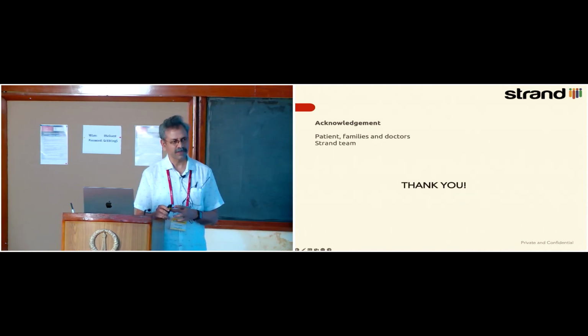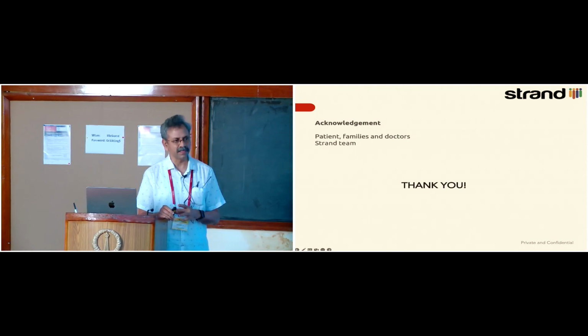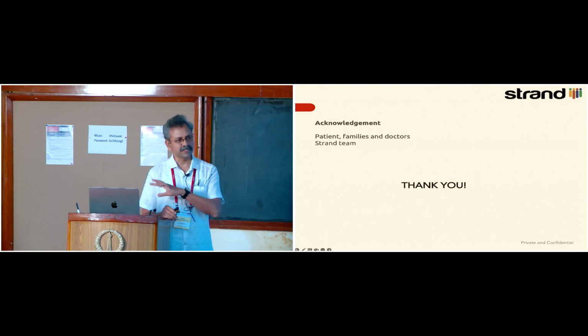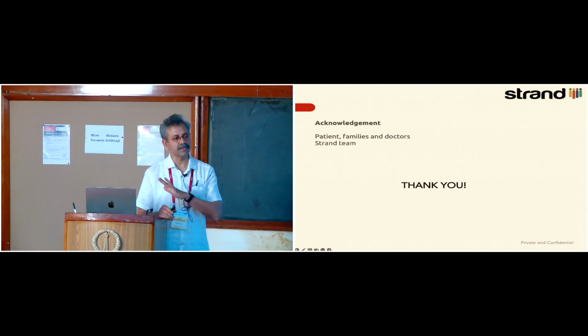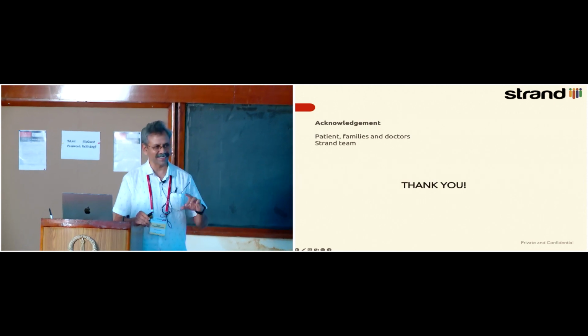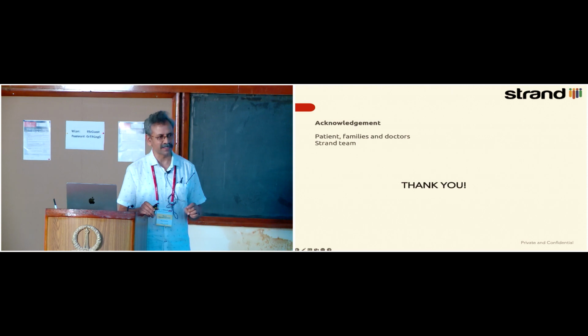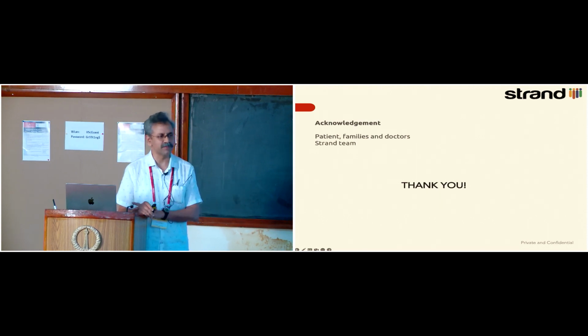So if I were to pick one challenge, I would say it is reliable copy number detection at the exon level, in the context of all of these GC biases, and you cannot ignore the lab processes at all. You can't say that somebody has given me the data and I will just analyze it. You need to be aware of all of the lab metrics which could have caused batch effects. Taking those into account and calling out single exon events is the biggest problem we have right now.